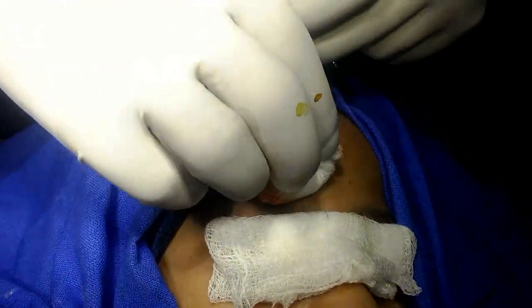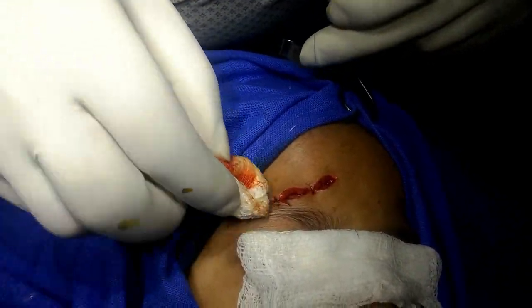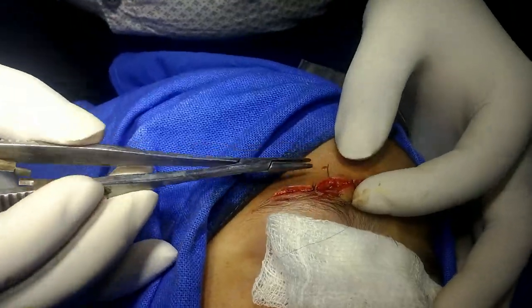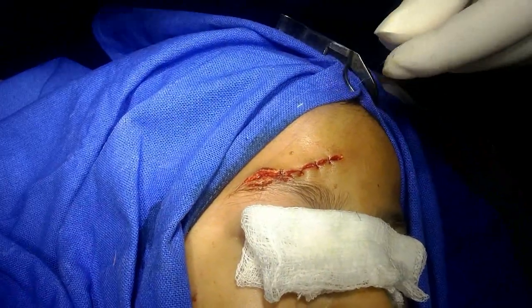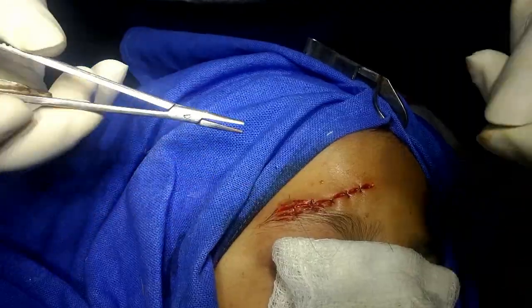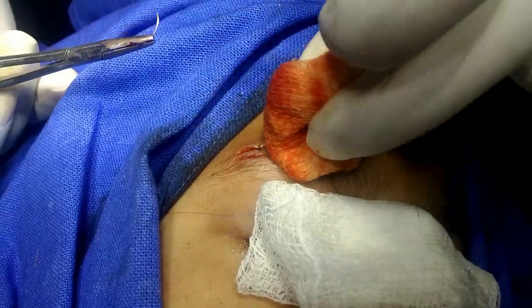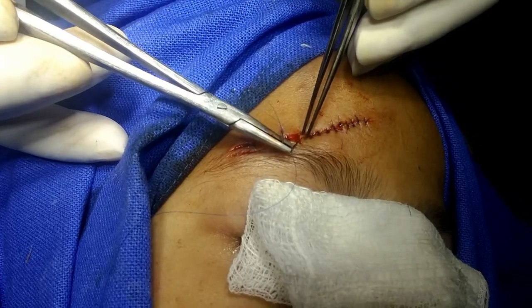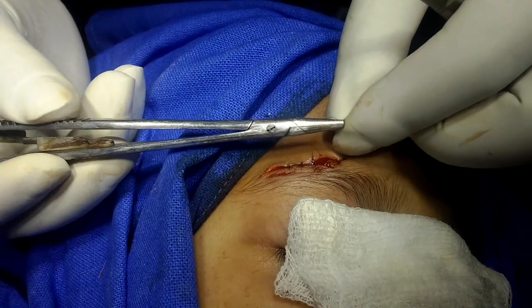I have divided the wound margin into three sections after proper alignment. There is a triangular flap here to repair. I take the bite from this flap, but the triangle is very small, so I am using very fine sutures.